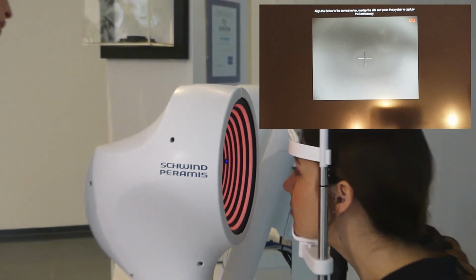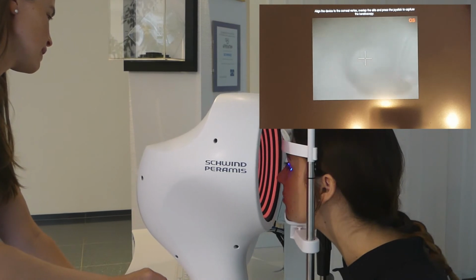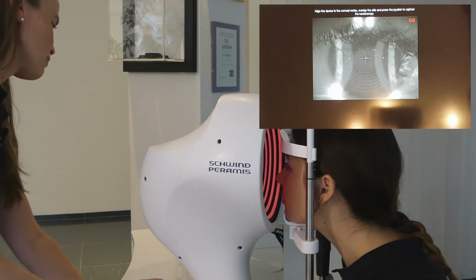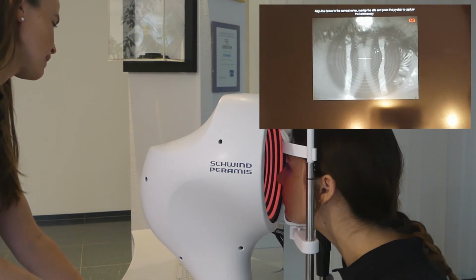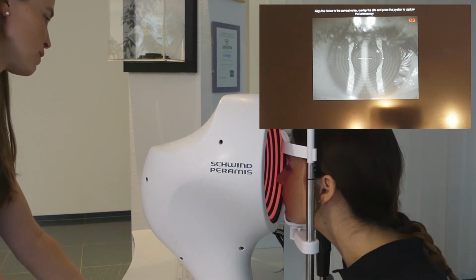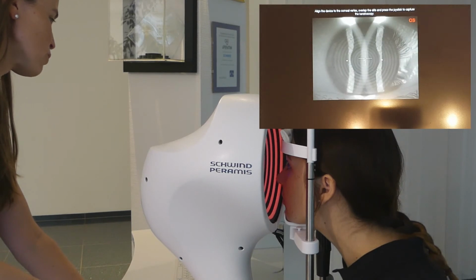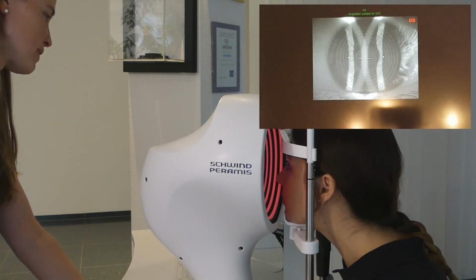I move the PERAMIS device to the left eye, searching for it. At first I have to center, and then I'm doing the perfect focus. Now patient, please blink and open wide, open as wide as possible, and keep open. Now I acquire my image by pressing the joystick button.